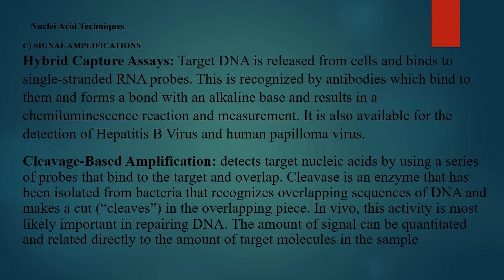So in this one, it detects a target nucleic acid by using a series of probes, and these probes have an overlap. Then cleavase is an enzyme that has the ability to recognize these overlaps and makes a cut in them. So that's hybrid capture assays and cleavage-based amplification.